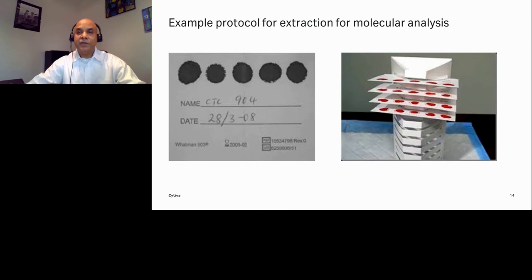Risks associated with shipping are minimized, as DBS cannot leak or be broken in transit, and there is no requirement for carriers on dry ice. Handling of potentially infected material is also reduced, as there is no need to centrifuge and separate serum from blood clots.